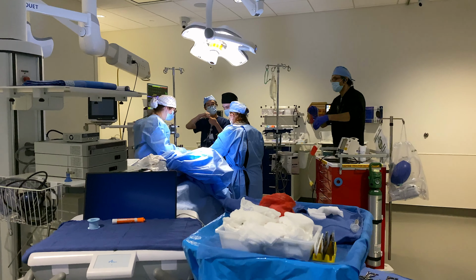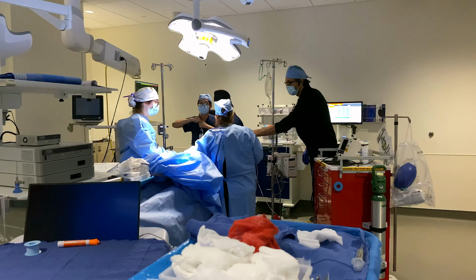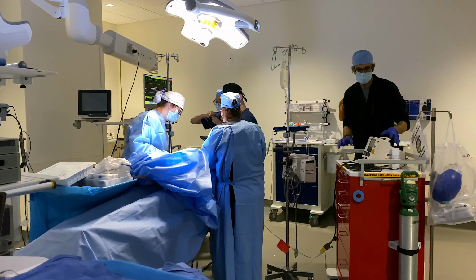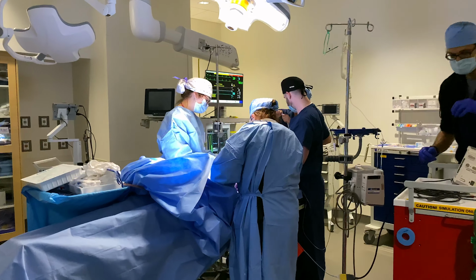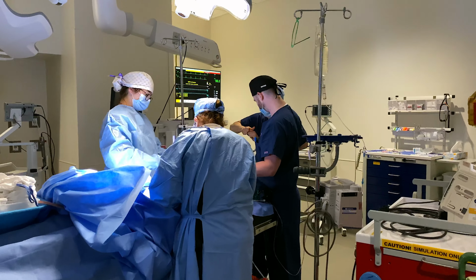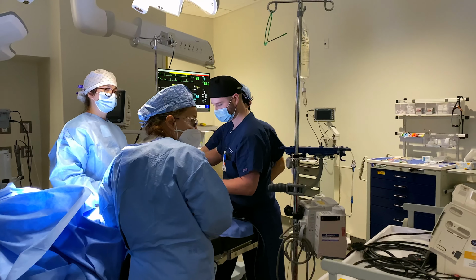Simulation can be an anxiety-provoking event. Number 1, the residents are being videotaped. Number 2, they're working in front of their peers. And number 3, they're dealing with a perioperative crisis with a lot of ambient artifactual noise and sounds and distractions.